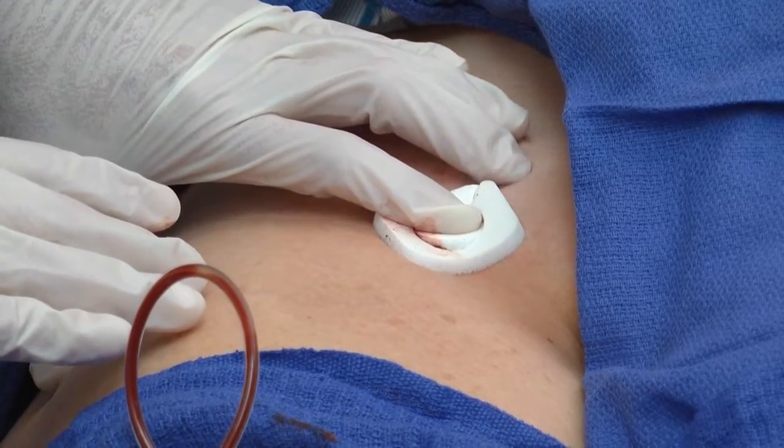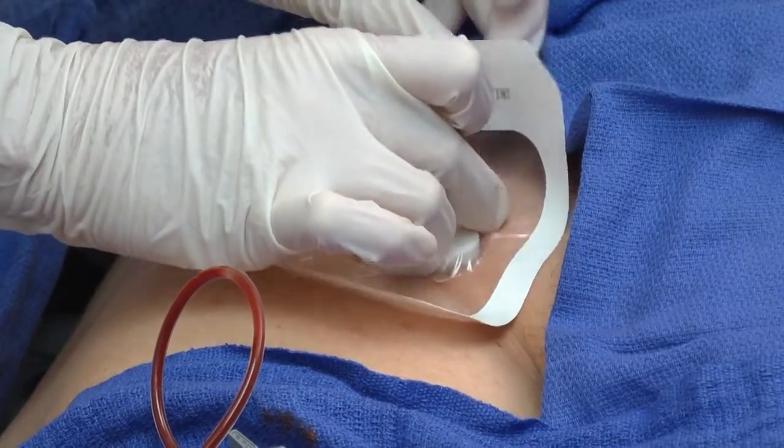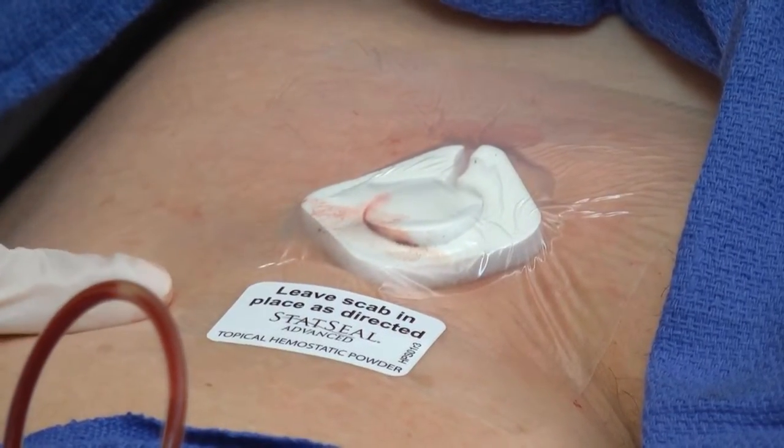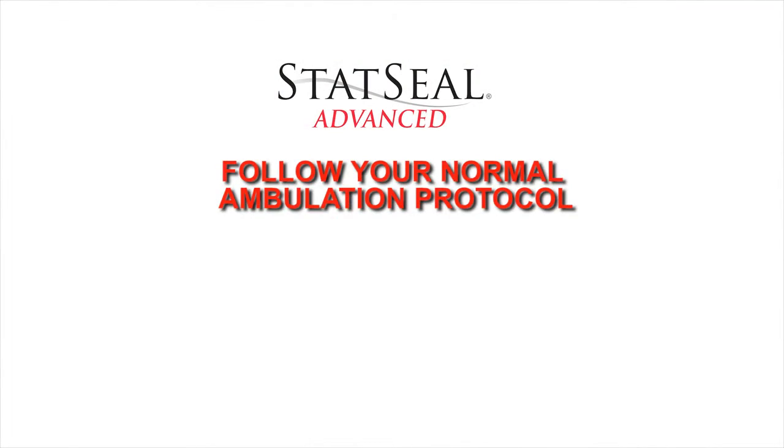Release pressure slowly while rolling your fingers off the PCD. Place a dressing per your facility's protocol. Apply the product description label on top of the dressing to identify the powder. Follow your normal ambulation protocol.